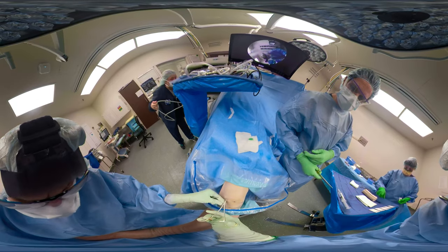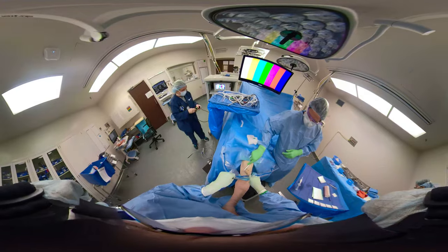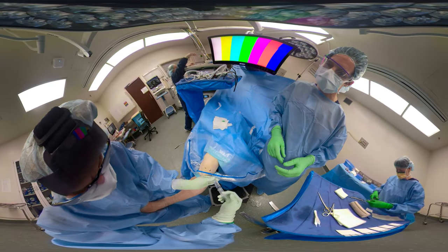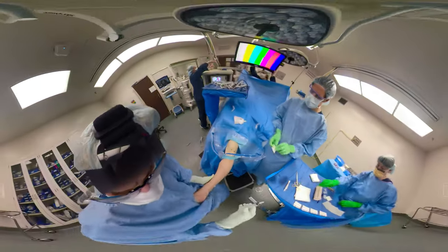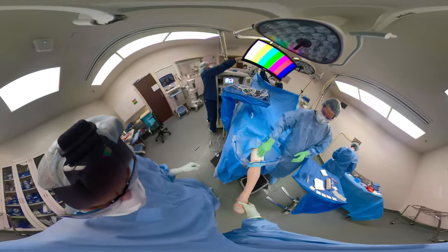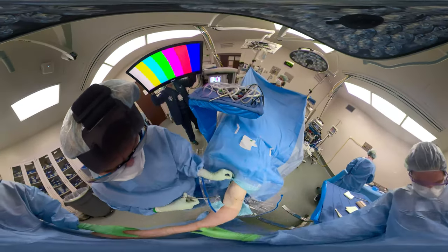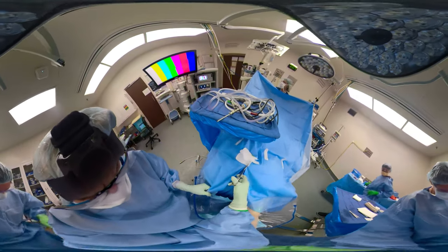You don't really need to put any Steri-Strips on there, but I do pad this very well with Adaptic 4x4s, Softroll, Ace Wrap. I do inject intra-articularly with Marcaine. You can go through the portal after you close it, or use your cannula to go through. Sometimes the medicine will tend to leak out through the portals. Now we just take the drapes off.